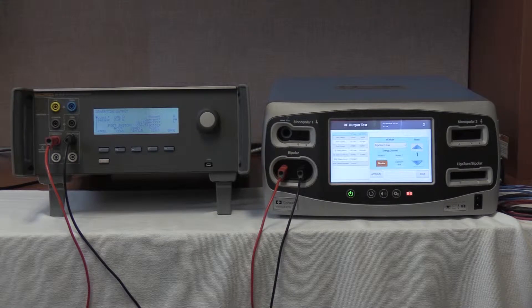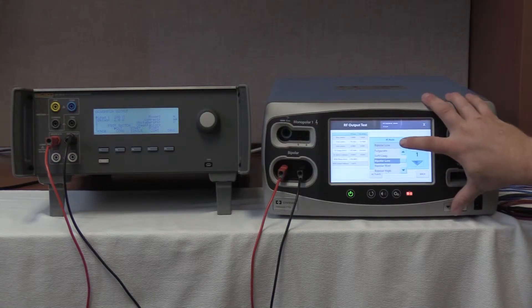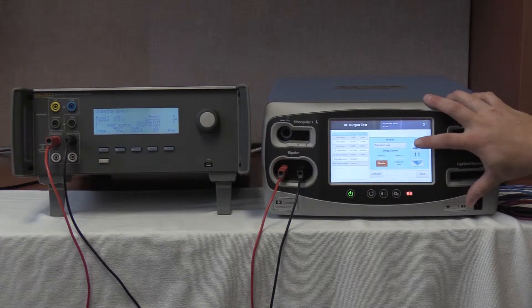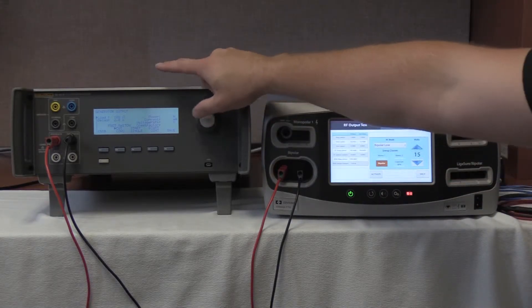The final test of the bipolar energy output at 100 ohm load is at 15 watts. We are going to go to the FT10, select RF mode, bipolar low. Once this is selected, we are going to increase to 15 watts. Once 15 watts is selected, we are going to go to 100 ohm load as referenced by our service manual.